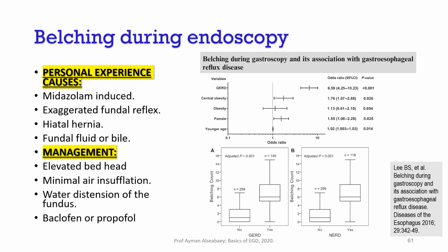When we are doing endoscopy, sometimes the patient belches gas and air from his stomach, and it affects the distensibility of the stomach, so you can't examine it well.